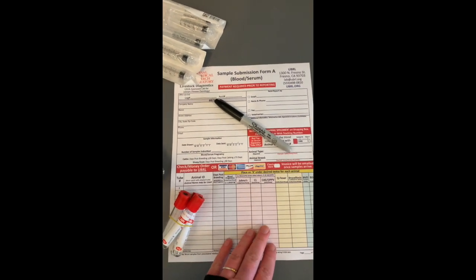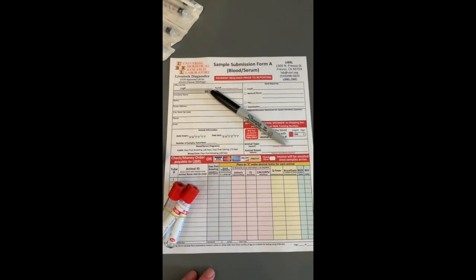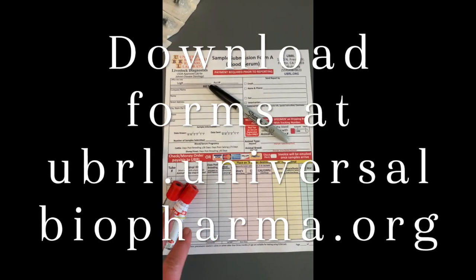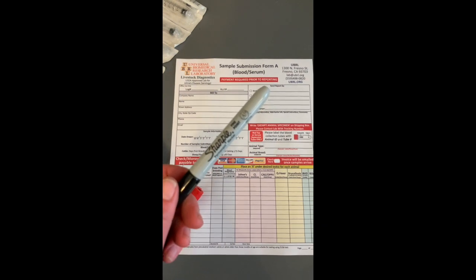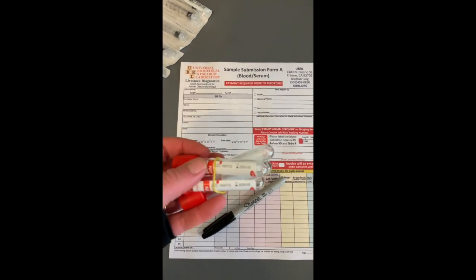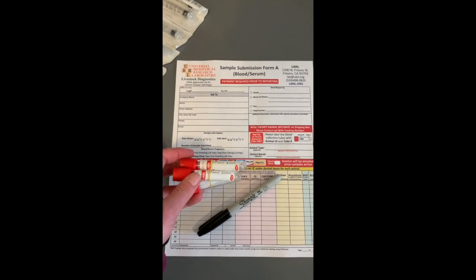I also have my paperwork from the lab. We're going to be sending these to UBRL in California — that will go along with these samples when they're shipped. Be sure to have a pen for this, but also a really nice sharp Sharpie for writing your animal's ID numbers and names on these tiny little tubes. So let's go out and start working with the goats.